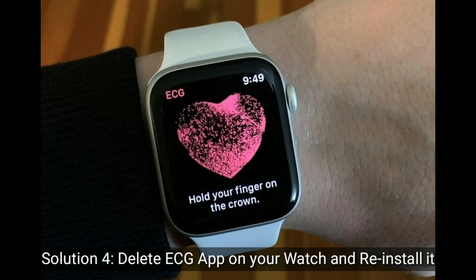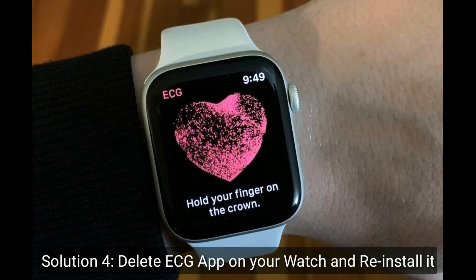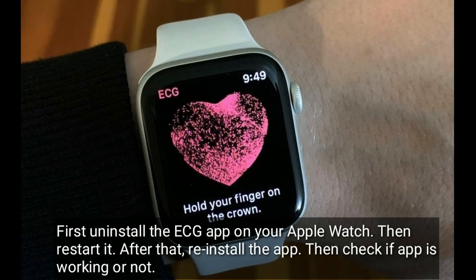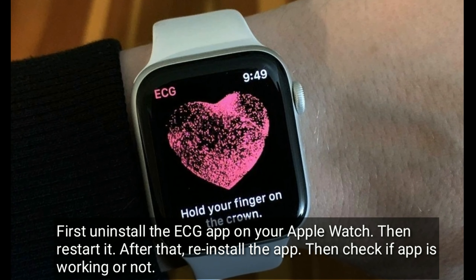Solution 4 is delete the ECG app on your watch and reinstall it. First uninstall the ECG app on your Apple Watch, then restart it. After that, reinstall the app and check if the app is working or not.